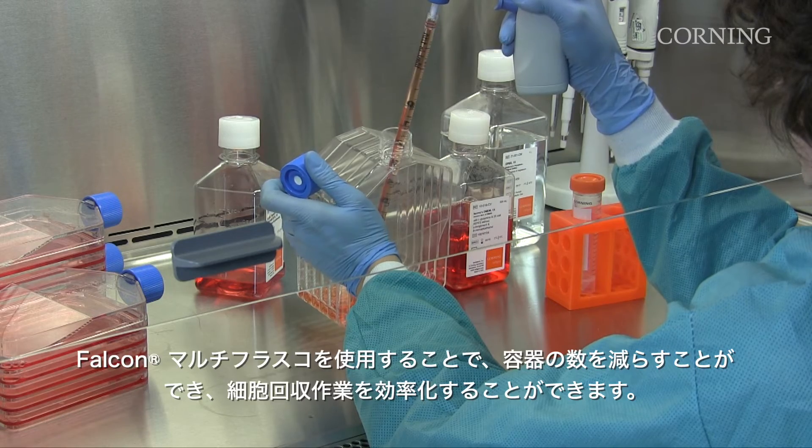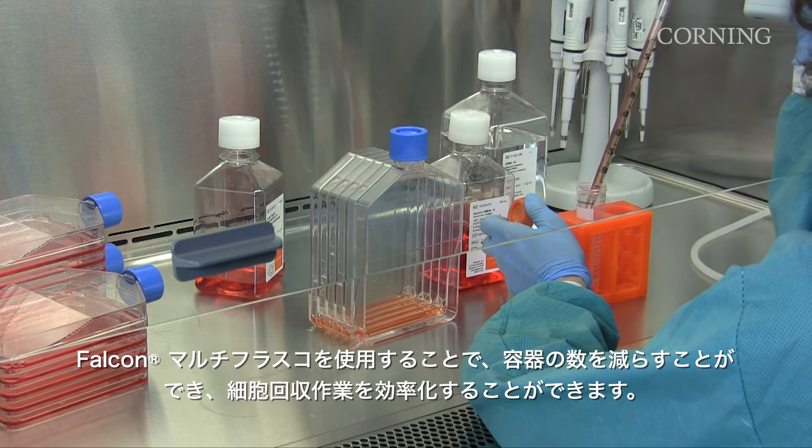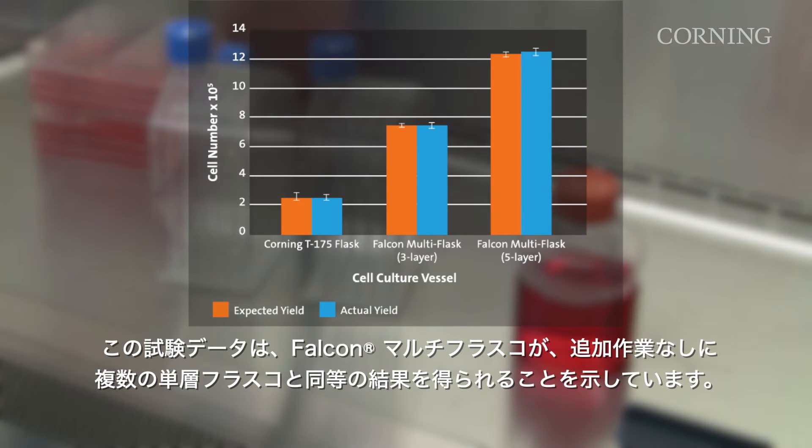By decreasing the number of vessels you have to work with, the Falcon Multiflask also streamlines your cell harvest. Test data demonstrates how Falcon Multiflasks can give you the same results you would expect to see from multiple single-layer flasks without the additional work.